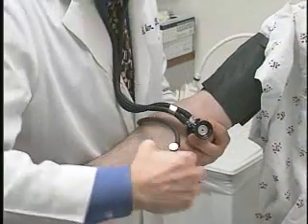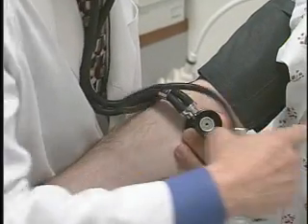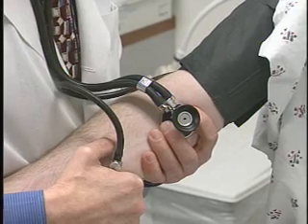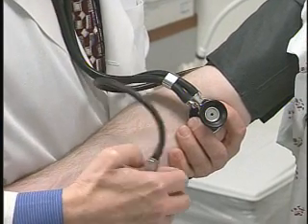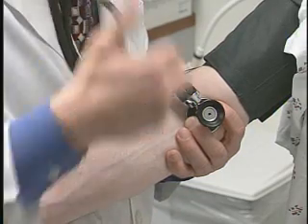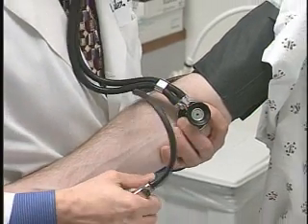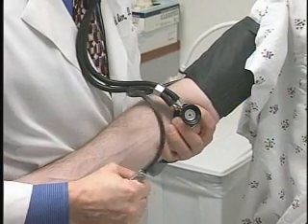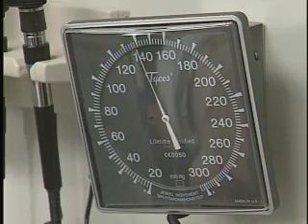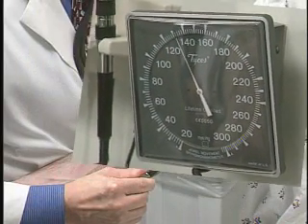his arm. You notice that the brachial artery should be about at the level of the heart, but the patient's arm should also be relaxed, so you as the doctor should be the one holding the arm up. Don't ask the patient to hold their arm up, because that again can falsely elevate their blood pressure. So close the cuff and the valve, and then slowly blow it up again, about 20 points again beyond where I felt the blood pressure disappear by palpation. I'm going to slowly release the air.